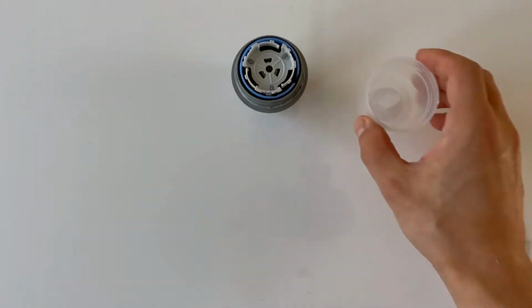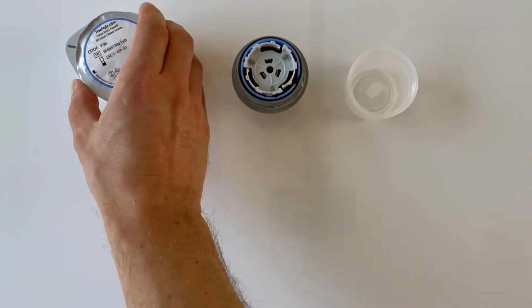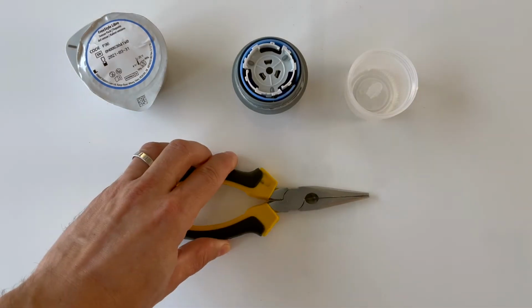The first one is a DIY solution, something you can do on your own no matter where you live. Just keep in mind what I do and what I will show in this video is what I do in my country, and there are different waste disposal rules in different countries, so always make sure to follow your local waste disposal regulations. My method is simple. You're gonna need a used sensor applicator kit and pliers, nothing more.